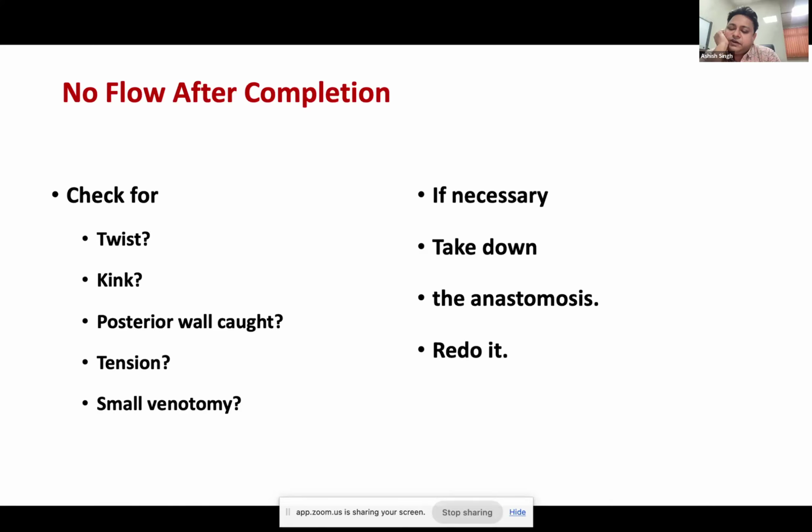Actually, every patient is different, so it may be very helpful in the area where you are working. But you should be very cautious while handling a very thin, fragile vein. In that case, it may tear off the vein from the margin. Okay. Yes, sir.